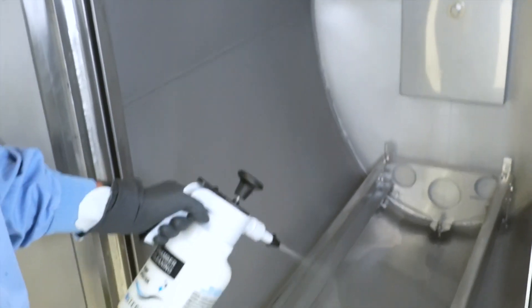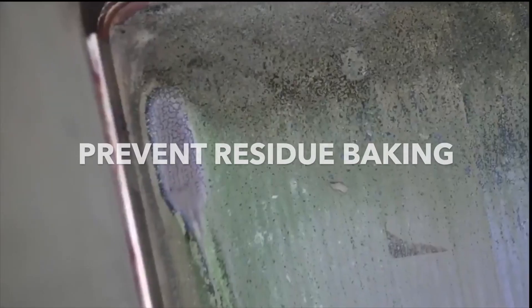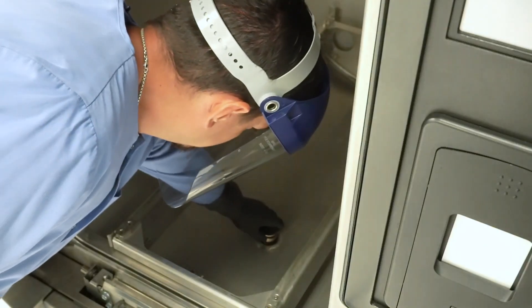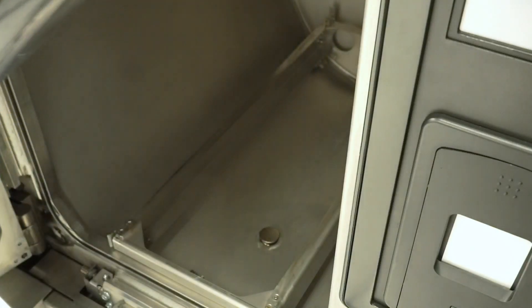Step 6: Rinse the bottom of the chamber with a small amount of water to prevent detergent residue from baking onto the surface. Step 7: Return the drain strainer to the drain.